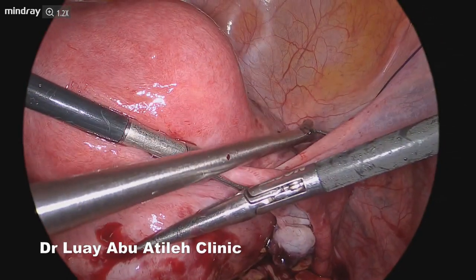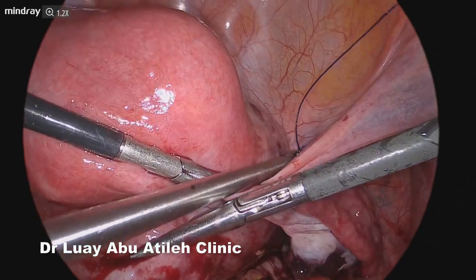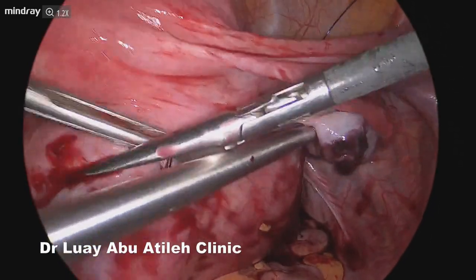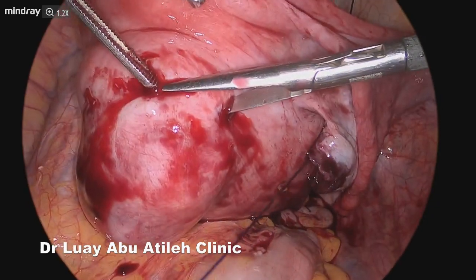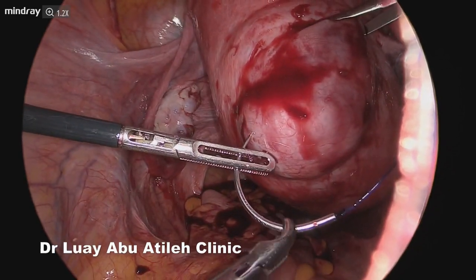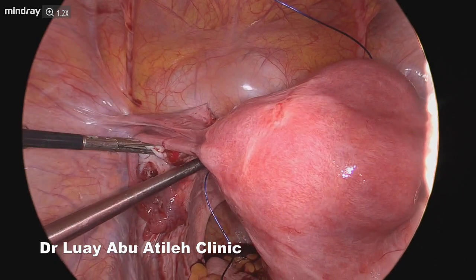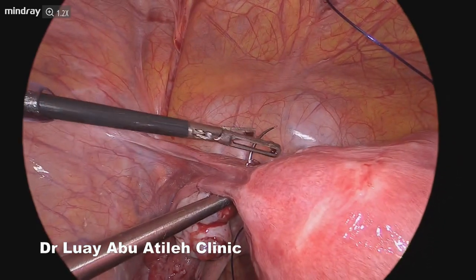We first introduced this PDS suture material through the suprapubic region, then took it lateral to the uterine artery at the level of the isthmus on the right side. In this case, it was challenging because the fibroid was occupying the right side. Then we took it to the other side at the same isthmic level, lateral to the uterine artery in the avascular space.